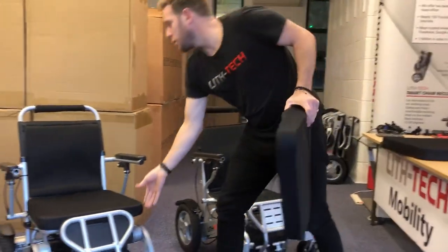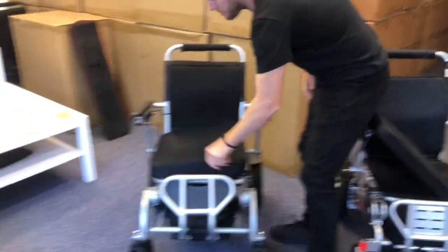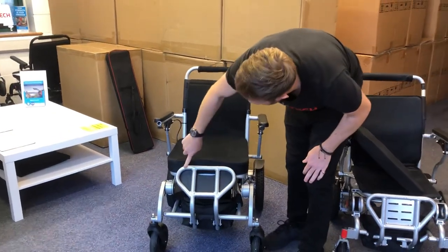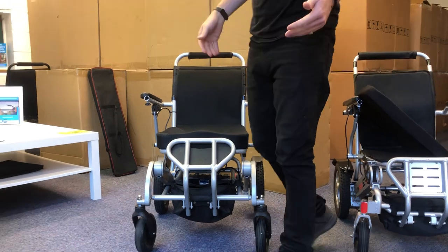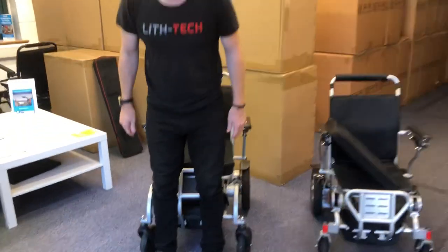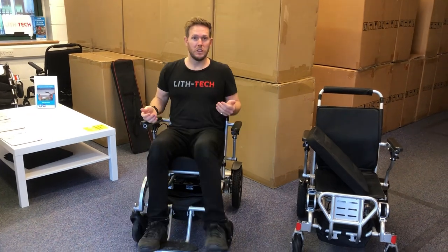I'm just going to show you now with that cushion swapped over on the X. Whereas before it was in line with the foot plate, it's now sitting above it. So even on the X — which is quite a tricky chair for getting in from the front with the foot plate on — it now makes it much, much easier.